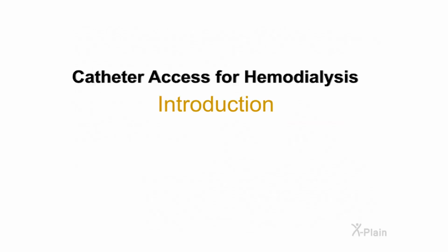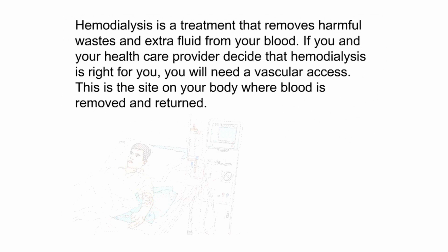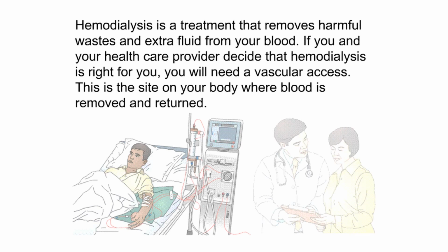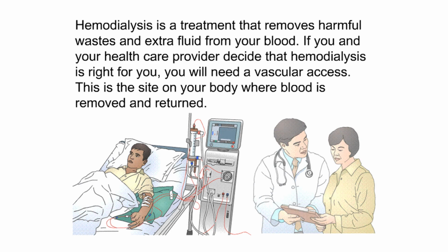Catheter Access for Hemodialysis. Introduction. Hemodialysis is a treatment that removes harmful wastes and extra fluid from your blood. If you and your healthcare provider decide that hemodialysis is right for you, you will need a vascular access. This is the site on your body where blood is removed and returned.